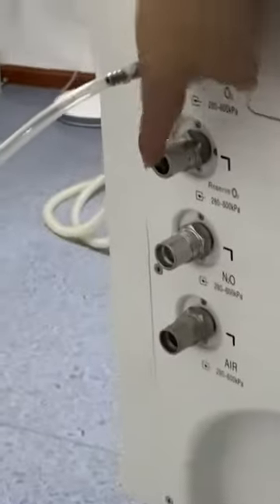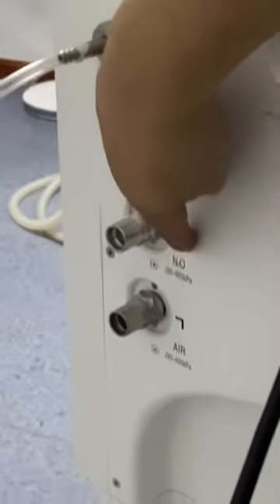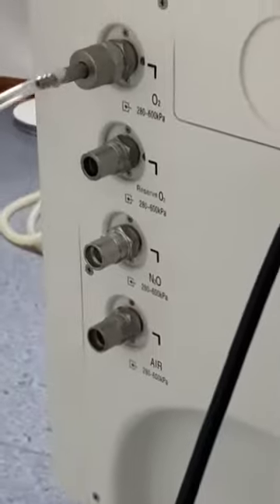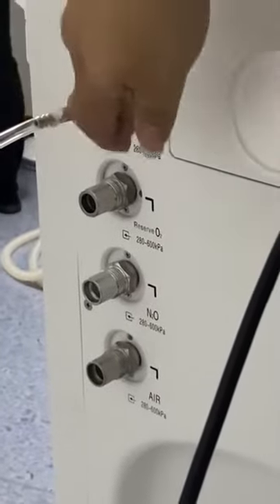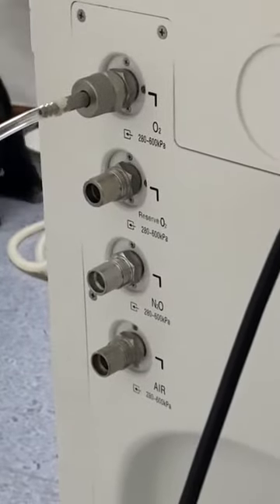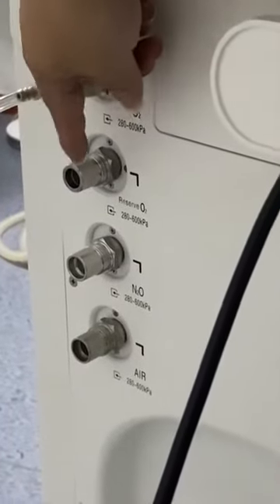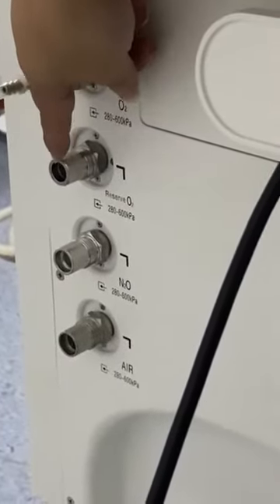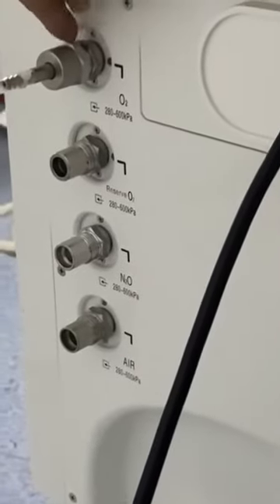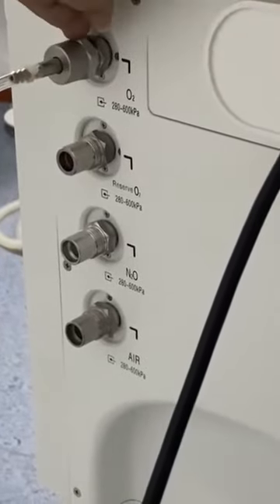And here we have 4 gas sockets. The first ones, you can see, we have 2 oxygen, 1 for nitrous oxide and 1 for air. Because oxygen is the driving gas for this machine, we have 2 oxygen. So how can we use it? For example, if you have both the central oxygen supply and the oxygen cylinder, then we can connect the central oxygen supply with the first one, and the second one connects with the oxygen cylinder. So once the central gas supply has a problem, the cylinder will give the gas. Once the cylinder has a problem, the other one will also automatically change. So it will ensure the machine always has oxygen and can always be used properly.